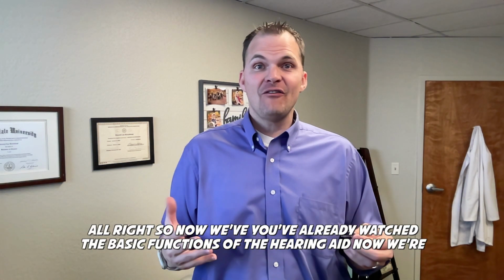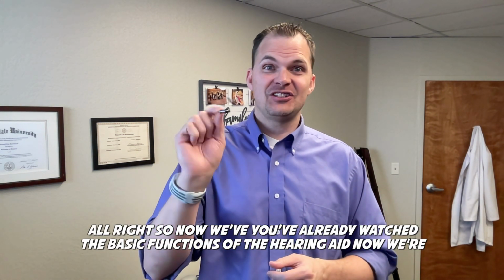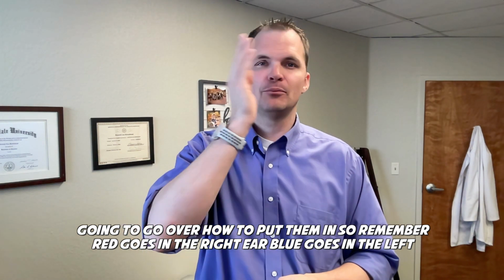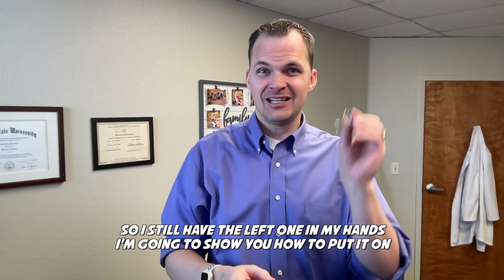All right, so now you've already watched the basic functions of the hearing aid. Now we're going to go over how to put them in. So remember, red goes in the right ear, blue goes in the left. So I still have the left one in my hands. I'm going to show you how to put it on.